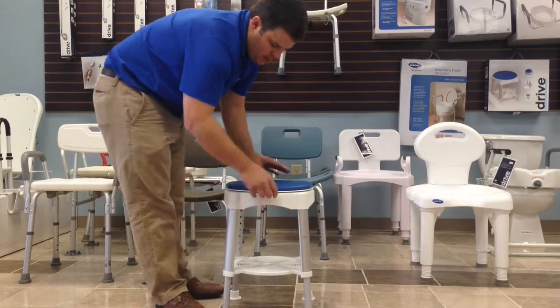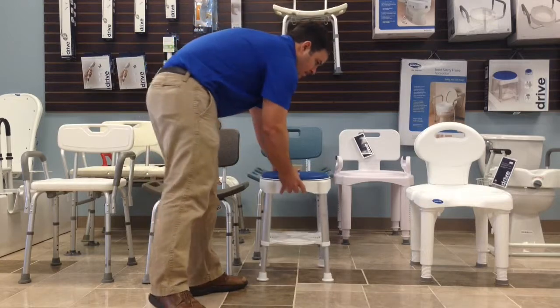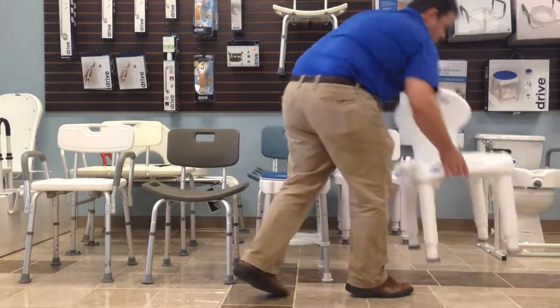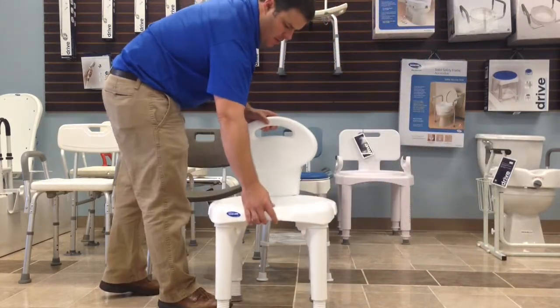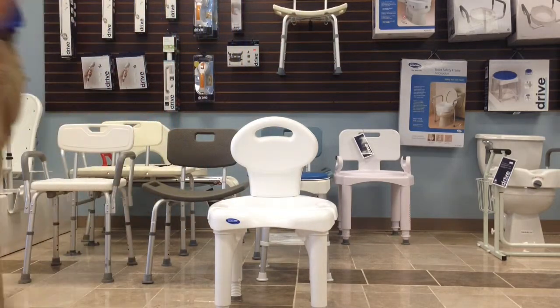This one has a pivot seat at the top and also a place to put product underneath while showering. The other shower chair here has a wider base for you to sit down on. You can give us a call at 730-9438.